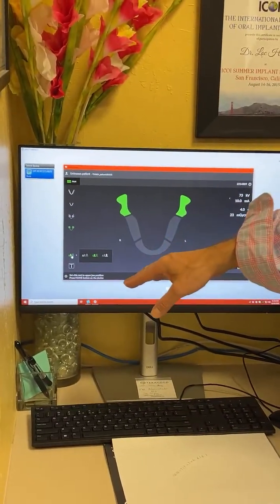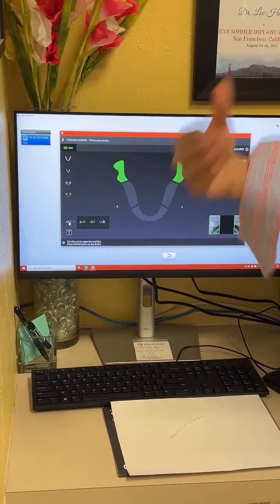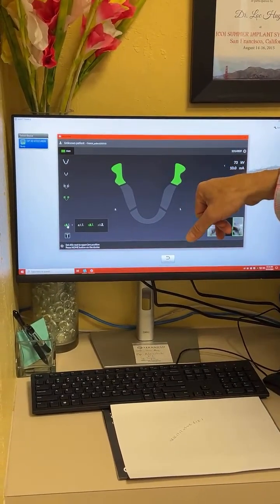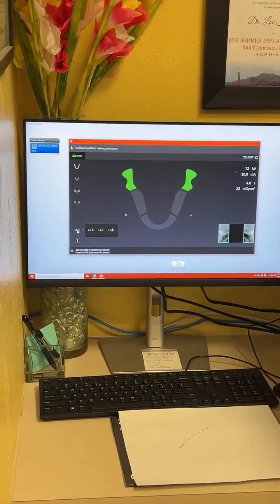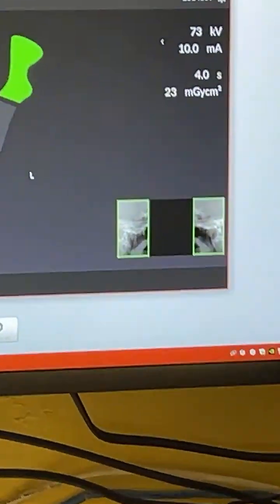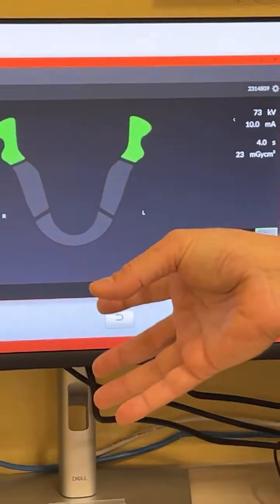These are defaults. The manufacturer, my company, is saying these are 3 presets that fit most people. If you want to customize, you can, but then you need to know what you're doing. Somebody that's really big, like Shaq, with a big giant head, you're gonna go high. If you have somebody who's a little bit petite, frail, on the smaller side, you're gonna go lower. But medium is a good starting point for most people.